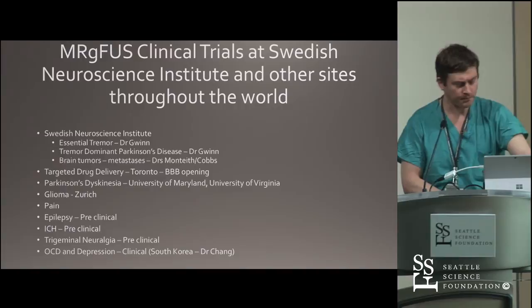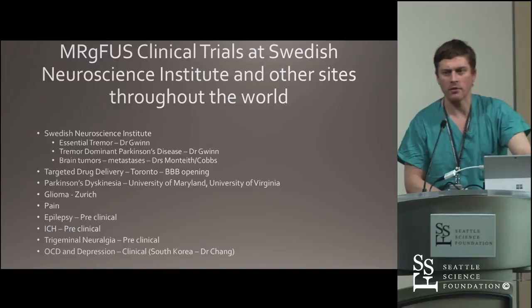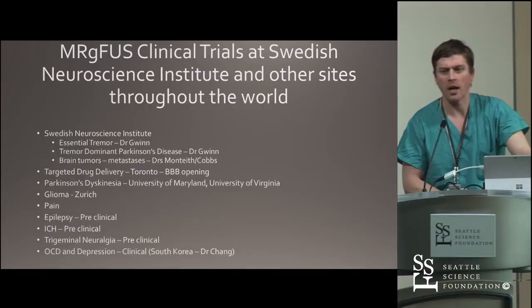Gliomas are still ongoing in Zurich, pain treatment in Switzerland as well. We're looking at epilepsy as well as ICH as potential targets. I'll talk about that shortly. And OCD and depression is being currently treated by Dr. Chang in Korea with good results so far.